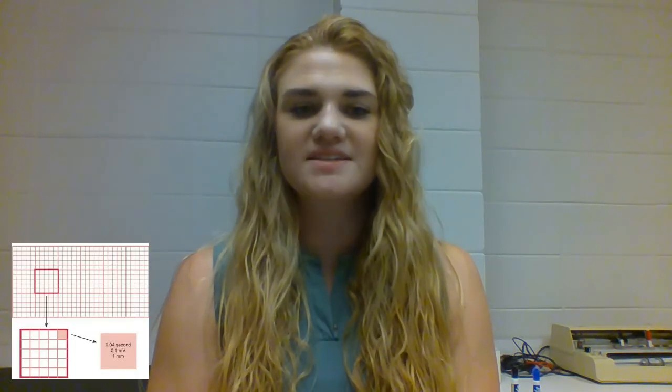An ECG tracing can provide information to determine heart rate, as well as amplitude and duration. Each of the cardiac cycle components has a specific amplitude and duration it needs to stay within. The ECG tracings are printed on graph paper, which is divided into large and small boxes. Each large box is 5 millimeters, representing 0.5 millivolts and 0.20 seconds. Each small box is 1 millimeter, representing 0.1 millivolts and 0.04 seconds.